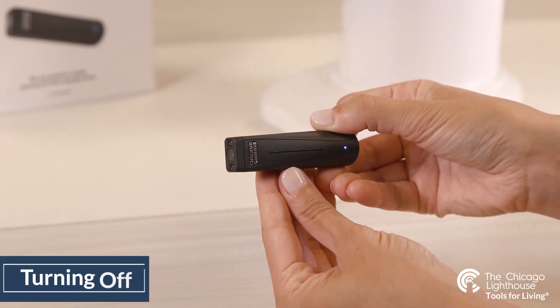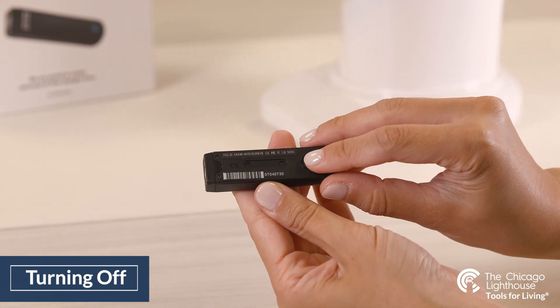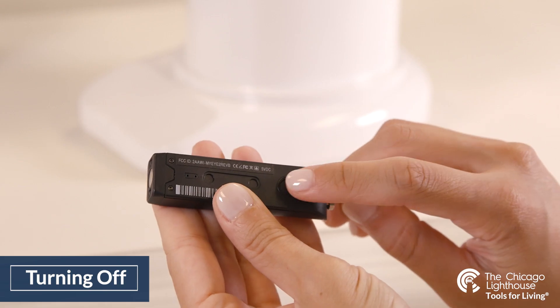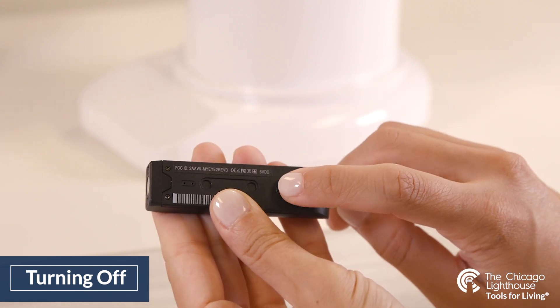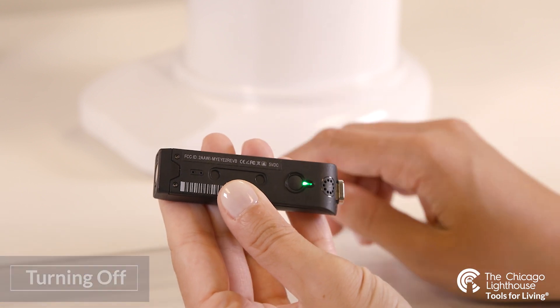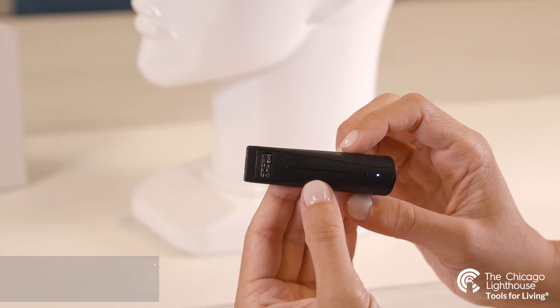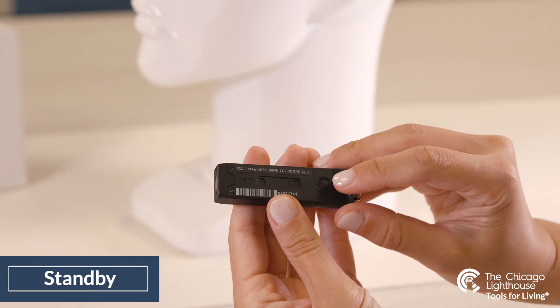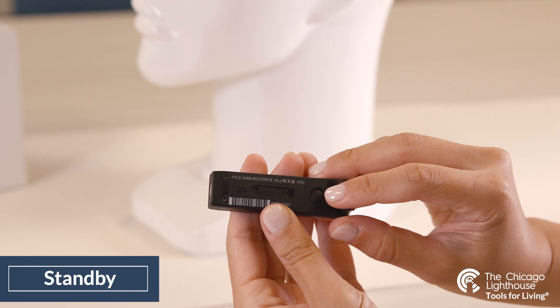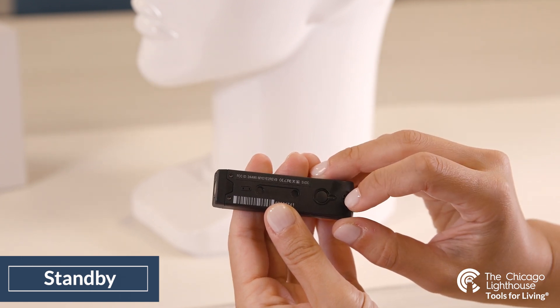To turn off the device, press the back side button once. The OrCam will say "Suspending — please press again to shut down." If you want your device to stay on standby, meaning it is asleep rather than off, you can leave it suspended by not pressing the button again. If you'd like to turn the device off, press the button again immediately after it says "Suspending" and it should then say "Shutting down" and turn itself off.